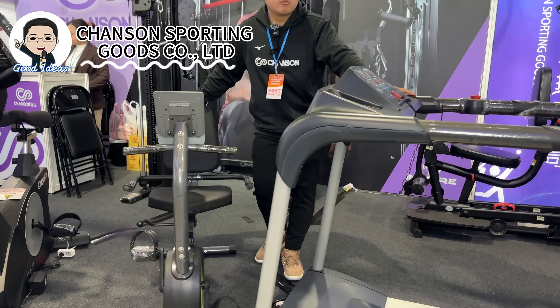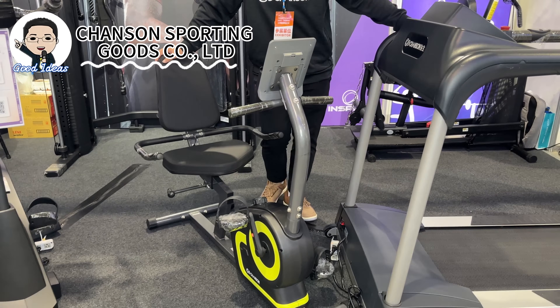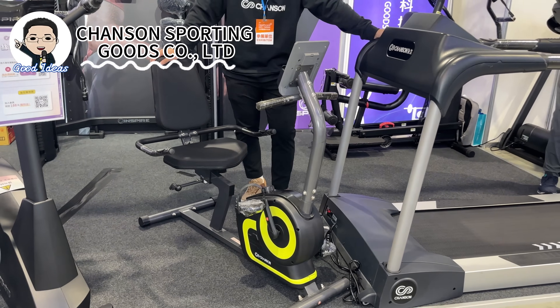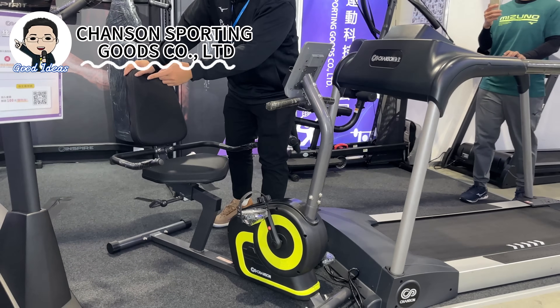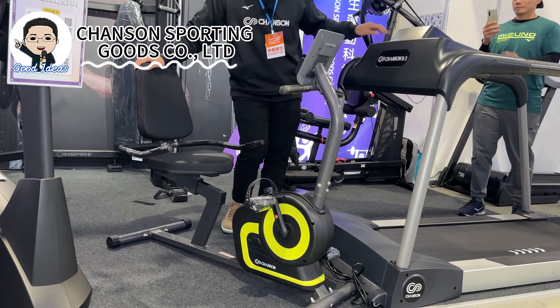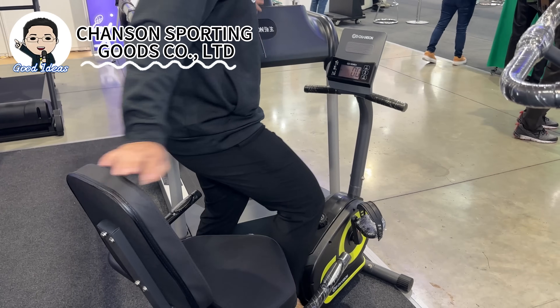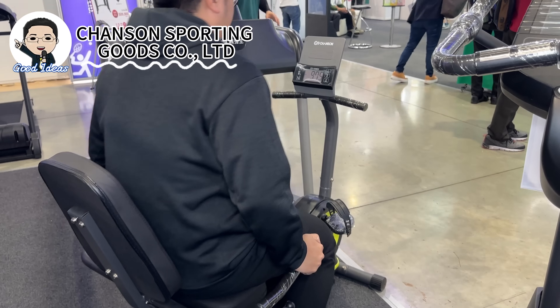This is another cycle that is highly used in physical therapist clinics and long-term care homes for elderly people. Unlike the other one which has a barrier, for elderly people who cannot move well, they can walk right in. It's like a chair attached to the cycle itself.